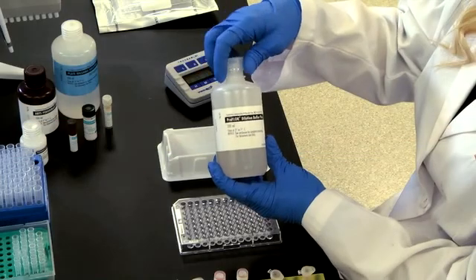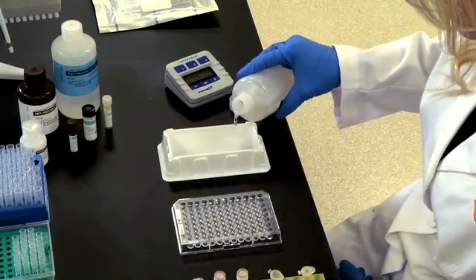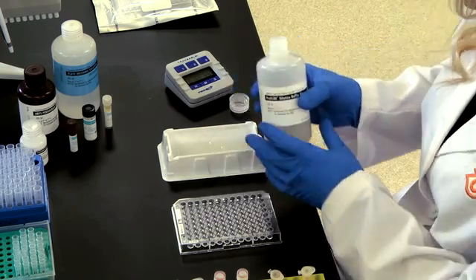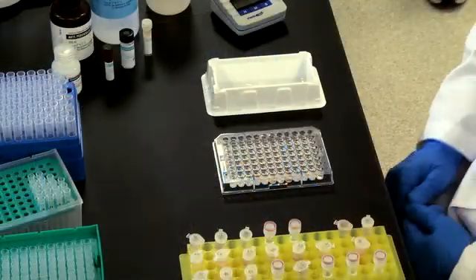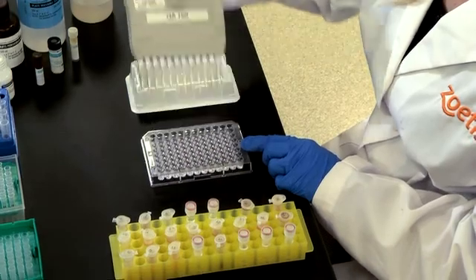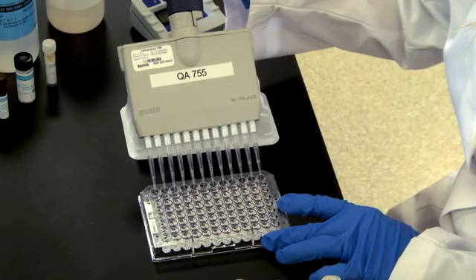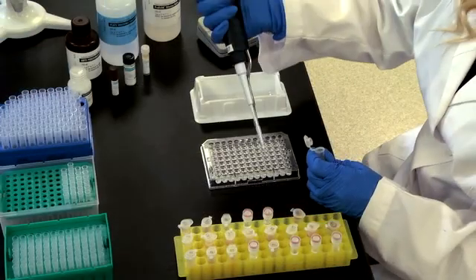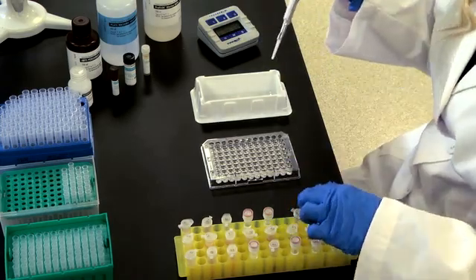Dilute serum using dilution buffer in a clean, uncoated 96-well microtiter plate. Frozen serum samples should be completely thawed, warmed to room temperature, and thoroughly mixed before diluting. Set up samples and controls as shown. Add 300 microliters of dilution buffer to each well of an uncoated 96-well microtiter plate — also referred to as the serum dilution plate. Next, add six microliters of unknown serum per well as per figure one in your directional insert, producing a 1 to 50 dilution.